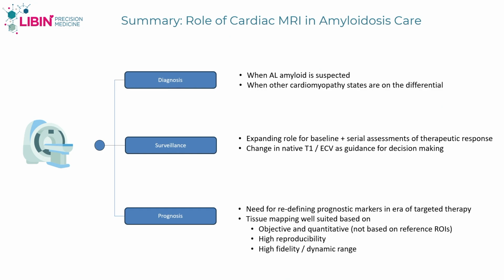But also, certainly, because of the era of pyrophosphate imaging, we are not the go-to first test anymore to tell you that ATTR is present. That is pyrophosphate imaging. We may be able to do that in the future, but it's not our role. Our role is really to give you quantitative measures that are accurate and reproducible to follow how much amyloid protein is in the system and is it changing over time. I think our quantitative measures are good for that.